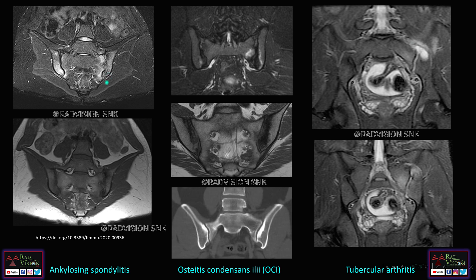This is bilateral symmetrical sacroiliitis with edema and irregular articular margins involving bilateral SI joints. There will also be widening of the SI joints initially, followed by narrowing in the latter stages. Whenever you see symmetrical bilateral sacroiliitis, definitely suspect ankylosing spondylitis. Initially there is widening of joint space, later there is narrowing, and predominantly there will be bony erosions and irregularity of articular margins predominantly involving the iliac aspect. Late stage shows narrowing with ankylosis.